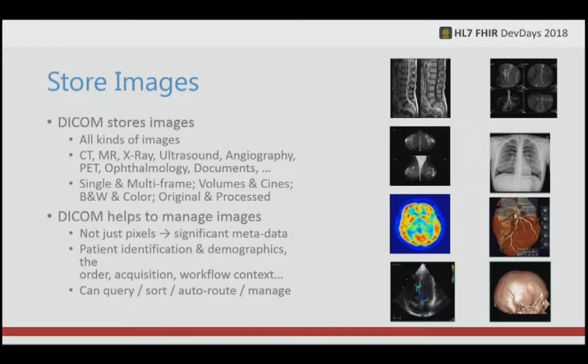We store images, all kinds of images, CTs and MRIs and all sorts of things. Single images as well as multi-frame, stacks of images. But it also goes beyond the imaging itself and also defines metadata. If you think about, you take a picture with your cell phone and you have a JPEG, and it also has the geodata, so you know where you took the picture, you know the type of device that was used. Very similar here, but DICOM also packages up patient identifier data and table position for scanning the patient and all sorts of other details.